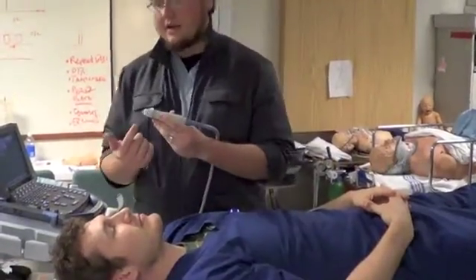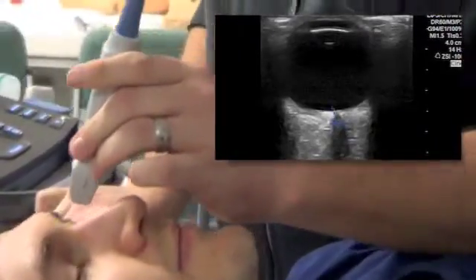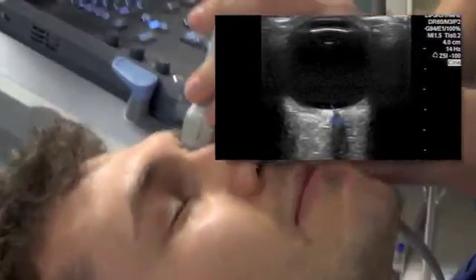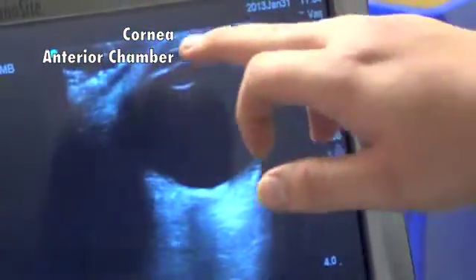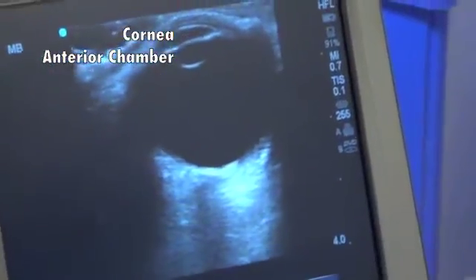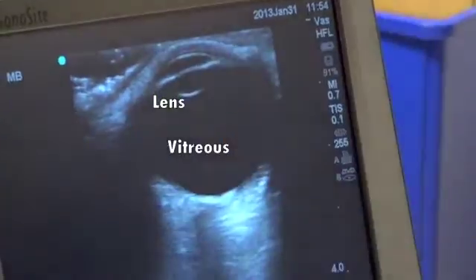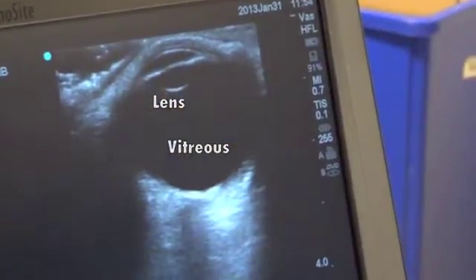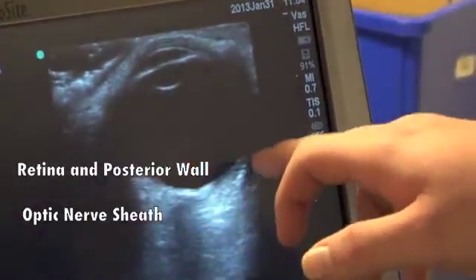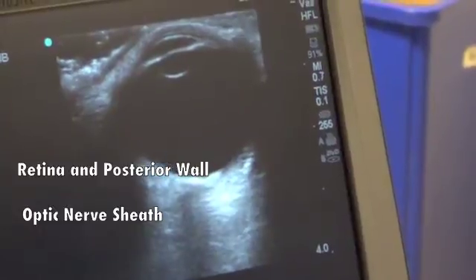You're going to have the indicator to the patient's right to first evaluate the image, and you're just going to lightly press it on the patient. The anterior-most part of the globe is going to be your cornea. You're going to have an anterior chamber, which is hypoechoic. You're going to have the middle iris, and the posterior hypoechoic structure is your lens.